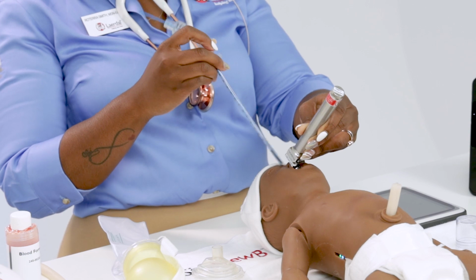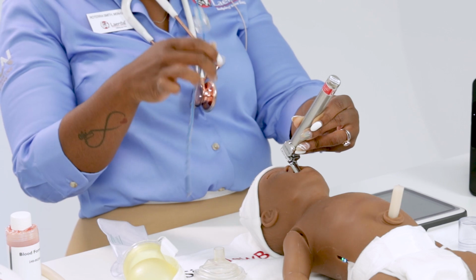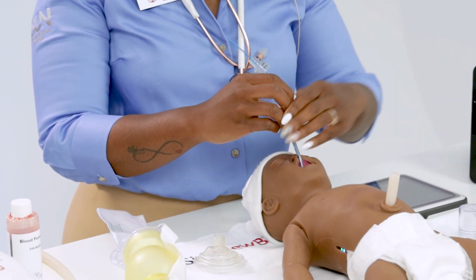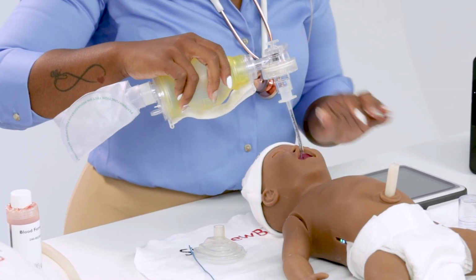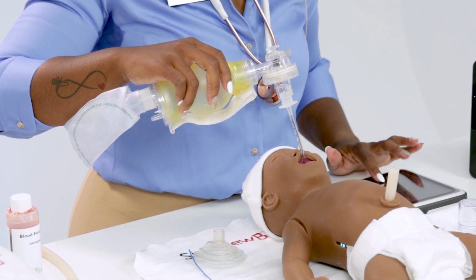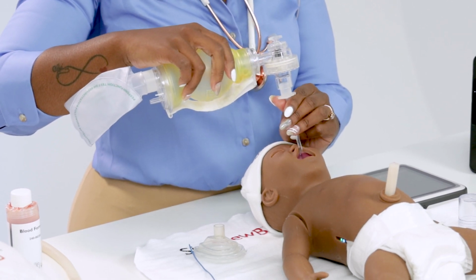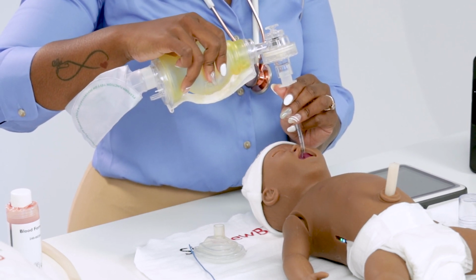Alrighty, I think I see, let's come back some. All right, I found the vocal cord and the trachea. We will see. All right, I feel the carina, so I'm probably too far, but we will check and see. All right, give me 1 second. All righty. Nope, clearly I'm right main stem. Great teaching point. So what we're going to do is go ahead and pull that back just a tad. And now I have good bilateral chest rise and chest fall.